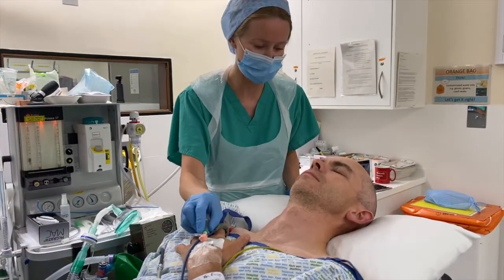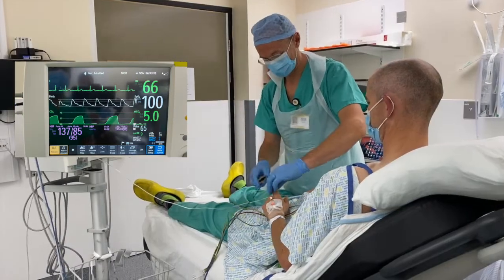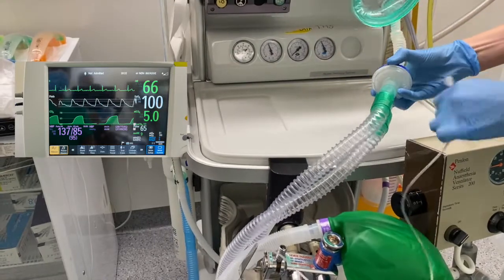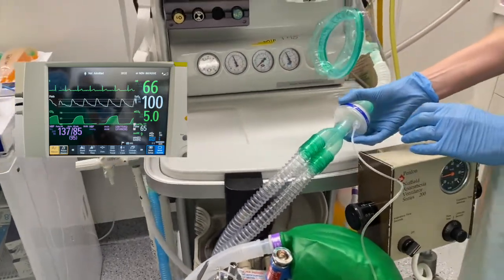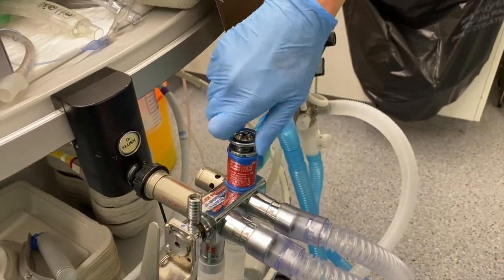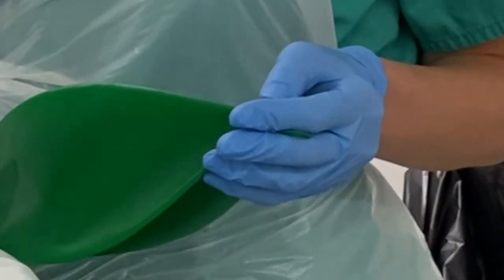Ensure that IV access is working and monitoring in place. You should have ECG, SATs monitor, non-invasive blood pressure, and capnography as minimum. Ensure capnography has been set up and ready to use. Confirm that the APL valve is open to allow the patient to breathe spontaneously with little resistance.